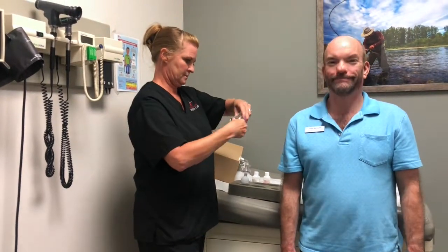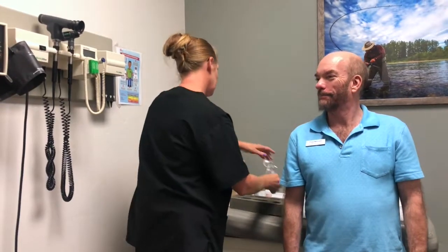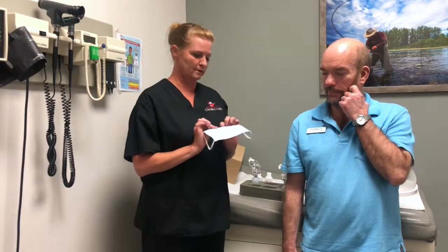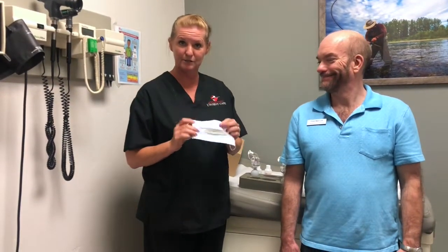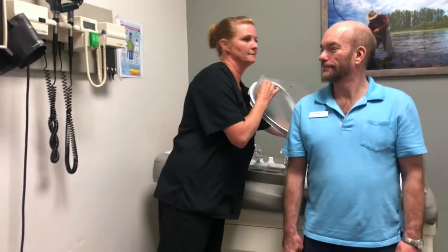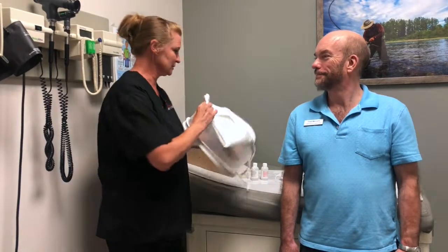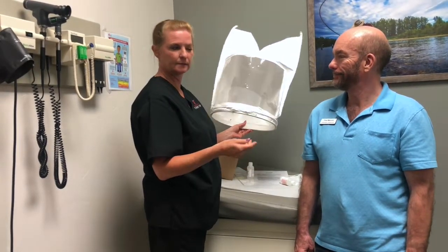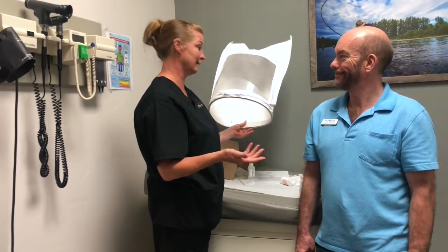How are you doing today? Did you bring your own mask? Did your employer provide you with a mask? Usually your employers will provide the employee with a mask to bring, or they will FedEx it to your clinic. It should be like an N95 mask, particle mask, or if they are required to wear an actual respirator, it will be a respirator. For the sake of demonstration since no one provided one, we're just going to use a regular medical mask today. Are you claustrophobic? Because this kind of encases you. If your patient is claustrophobic, just keep their eyes open looking at you and try to get through it. If they're claustrophobic, it's probably not a great idea to use a respirator anyway.